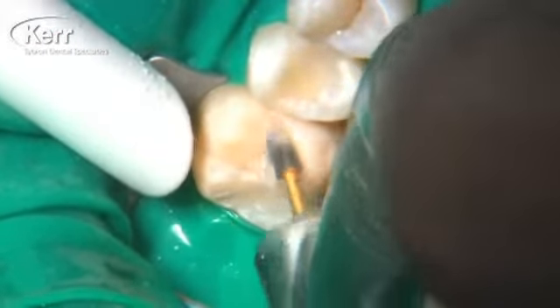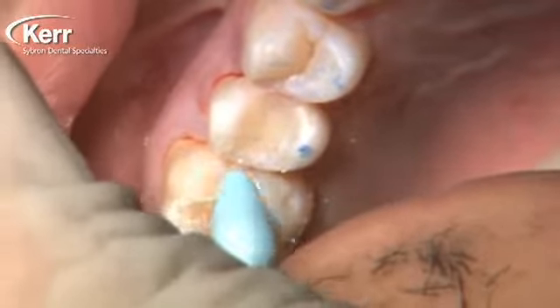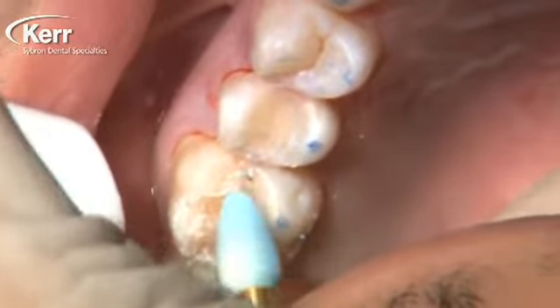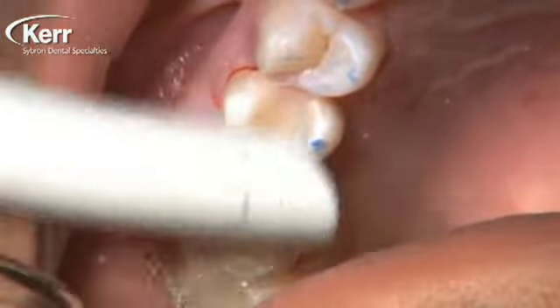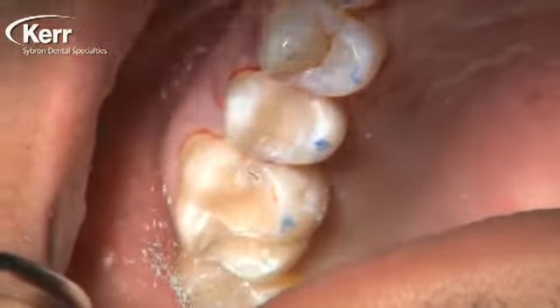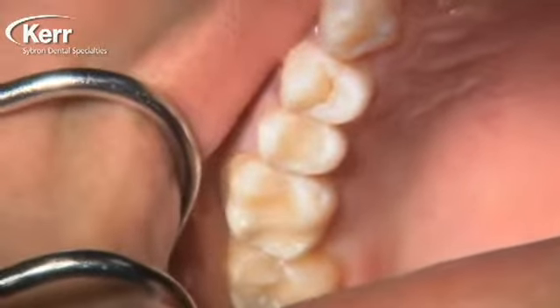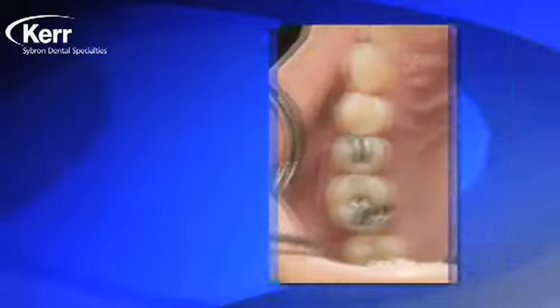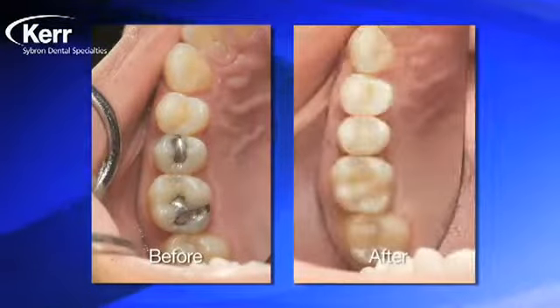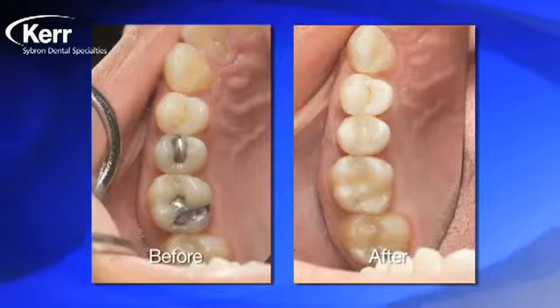We go in and do any finishing or polishing needed using the high luster composite points on these small restorations. One of the nice things about the enclosed brush is that you can shape the Vertice Flow with it so that when you cure it, you shouldn't have too much finishing to do afterwards. As you look at these restorations — the afters on the right — you can see just how well the A2 Vertice Flow disappears into the tooth. Look at all the steps we eliminated going from the before to the after.